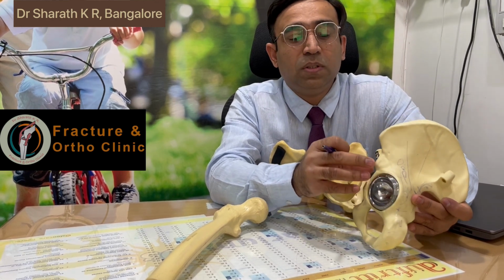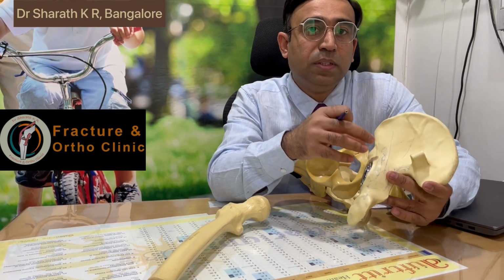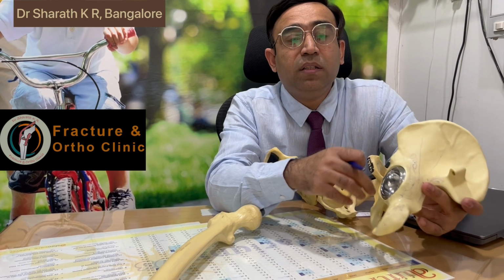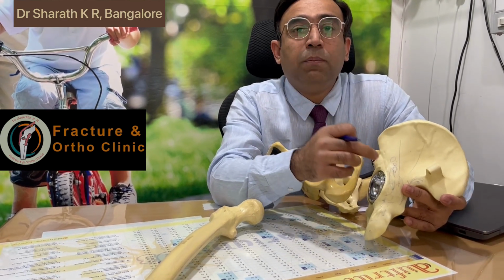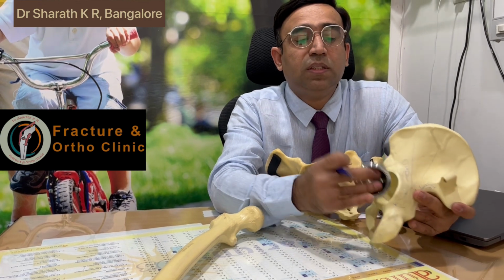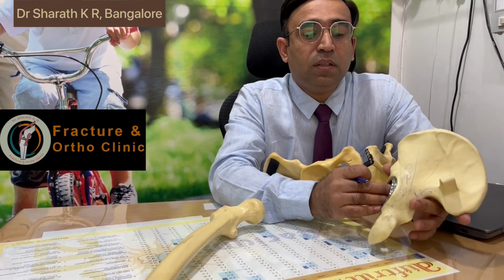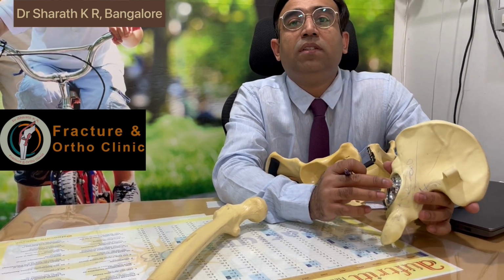Sometimes if there is loss of this, we will put bone graft, meaning we take bone from the bone bank and fix it, recreate this socket with the plate and screws, and then we put this acetabulum shell. Meaning this socket might not have its shape.